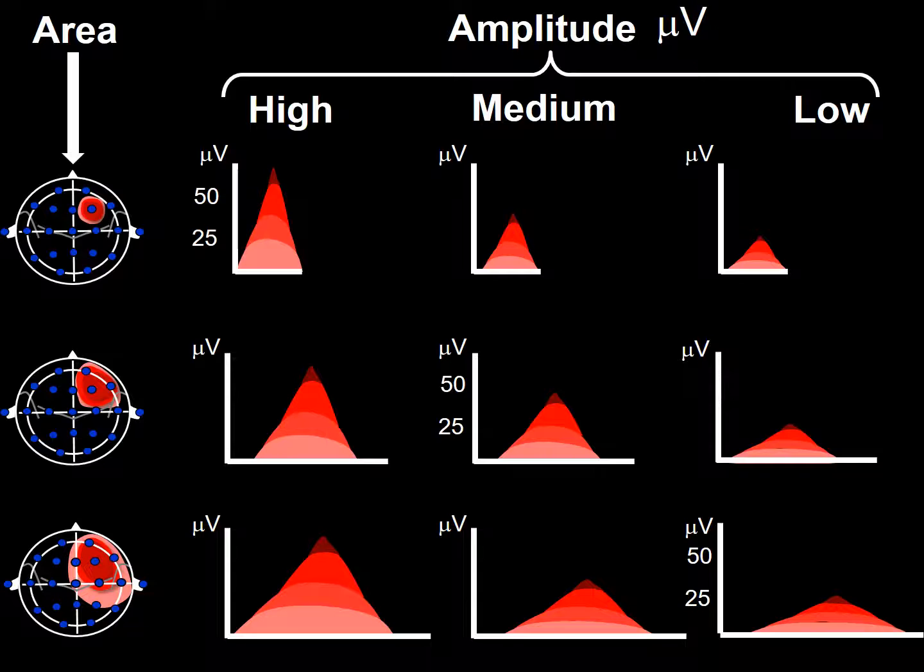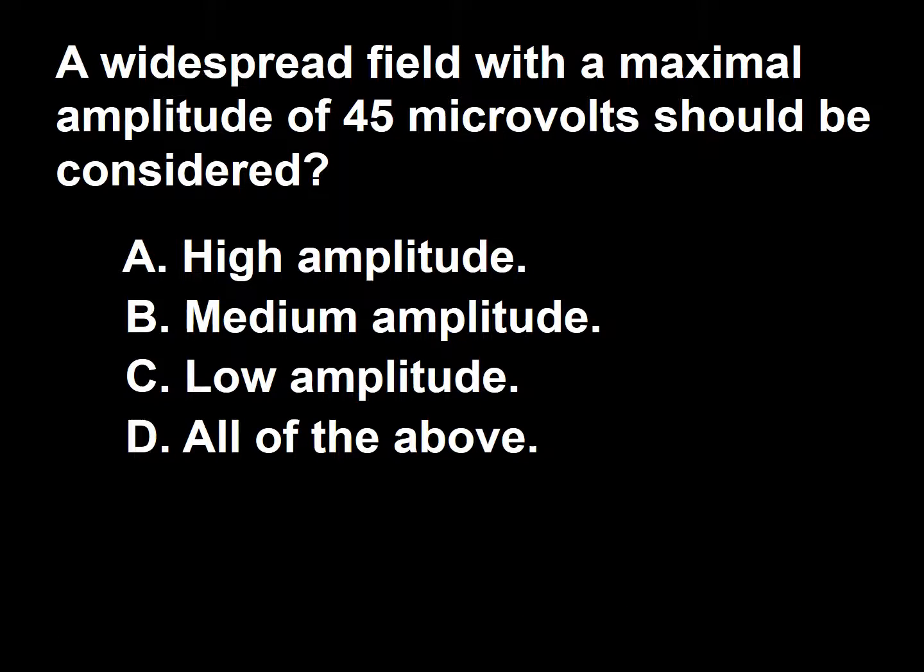The classification of fields according to amplitude is independent of the area involved. It is only based on the maximal amplitude of the field. So the answer to this question is B. Medium amplitude.